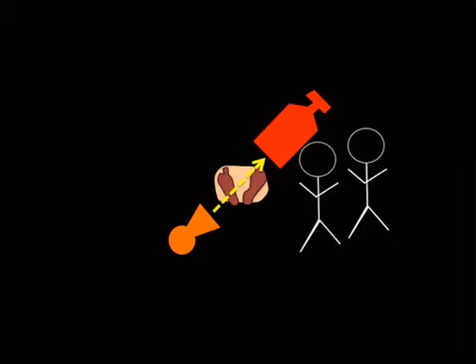All right. Actually, the best place to stand is behind your trainee, using them as a shield, and then reaching around them to do the case, because that lead, it's heavy. So as a point of trivia, the dose received, assuming that you're not wearing lead, standing 1 meter from the patient, is about 1/1000th of the dose received by the patient.